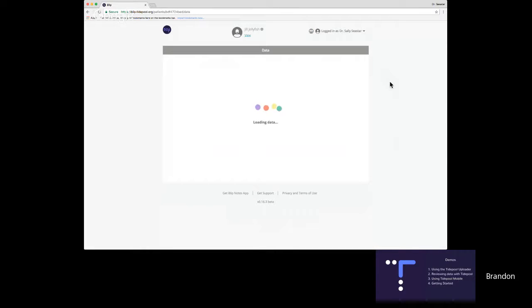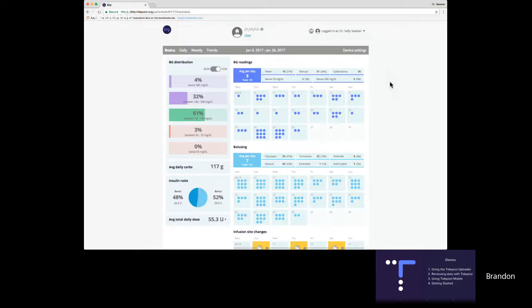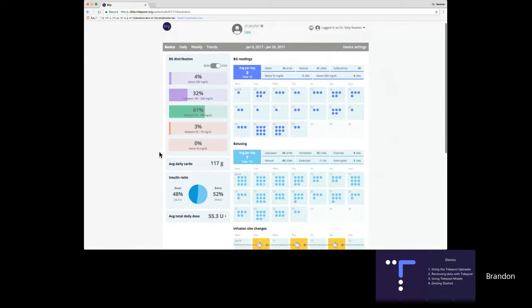Now we're loading Jill Jellyfish's data from Tidepool's secure, HIPAA-compliant cloud. I'm going to walk you through the screens. This first one is called the Basics. On the left side, we can see Jill's blood glucose distribution, her average daily carbs announced through her insulin pump, her basal-bolus ratio both as percentages and in units, and her average total daily dose.